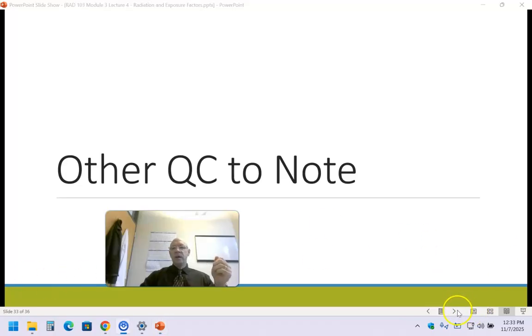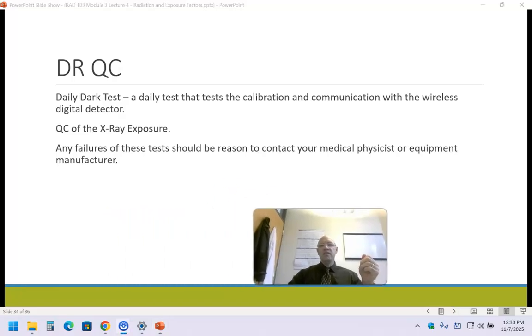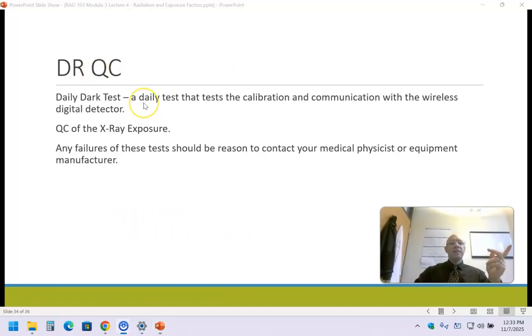I did want to talk about a couple other QC things, and this is just for your own information. We have a daily dark test for the Carestream equipment. So if you're not using Carestream, you've probably never seen this before. But if you're at school and you see a daily dark test must be done, it's just a way of kind of calibrating the plate because it's been off, the battery's been out of the back of it. And so this just kind of calibrates the pixels inside. And it also tests the communication with the wireless router attached to the control panel. So that's what the daily dark test is. Again, don't necessarily need to know that.